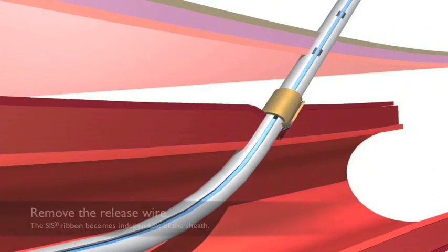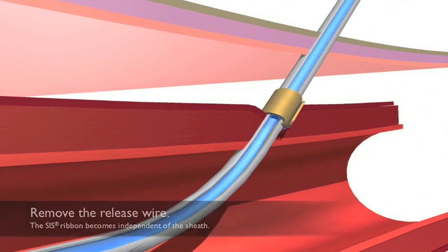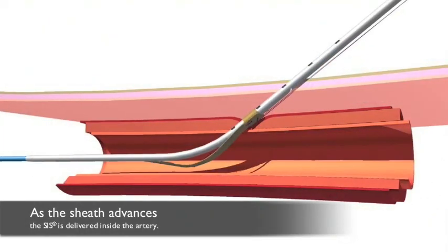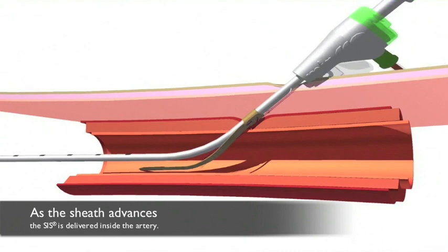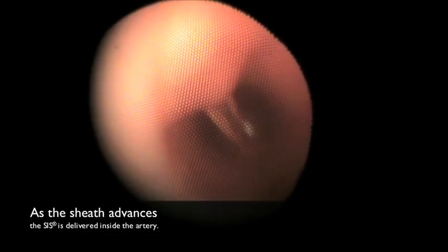With the matrix positioned at the arteriotomy, the stainless steel release wire can be removed by pulling on the release cap located at the proximal hub. When the release wire is pulled, it will allow the procedure sheath to be advanced into the working position by exposing a ribbon of the SIS matrix into the artery.